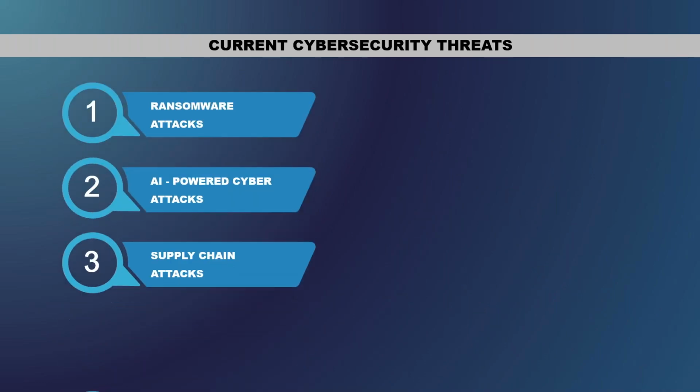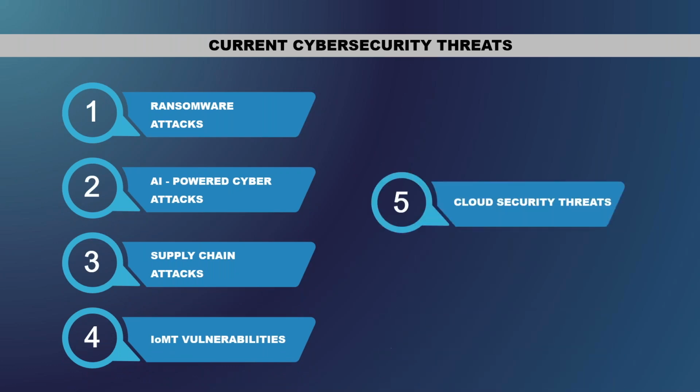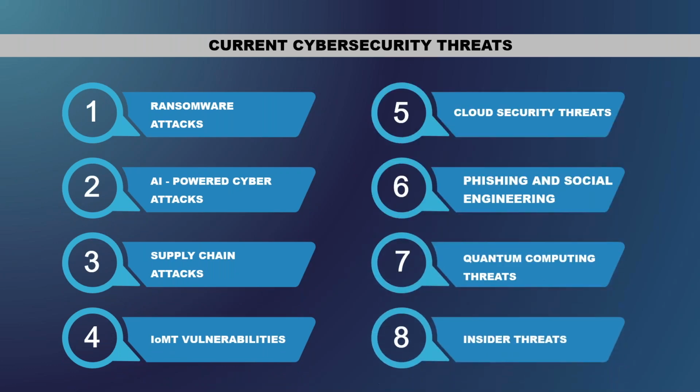And then current cybersecurity threats: we have eight cybersecurity threats facing healthcare organizations. For ransomware attacks, there are two threats, such as targeting attacks on cloud backups, logs, and archives, and attacking weak session connections that can stem from weak authentication or bad identity management. Utilizing AI can also create automated programs that mimic human behavior and can be used in credential stuffing, data scraping, and DDoS attacks.